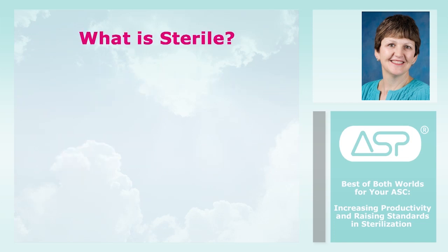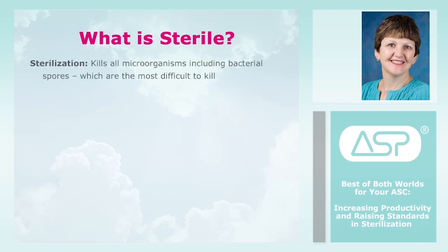As we begin our discussion of device sterilization, I think it's essential to start by looking at how sterilization is defined. Sterilization describes a process that destroys or eliminates all forms of microbial life, including bacteria, fungi, virus, and bacterial endospores.